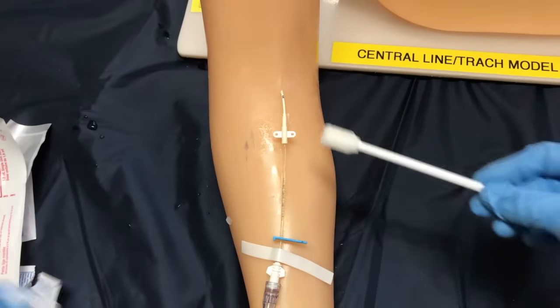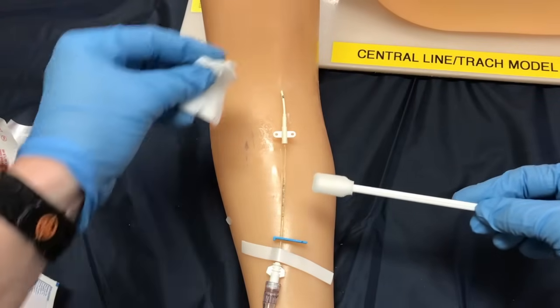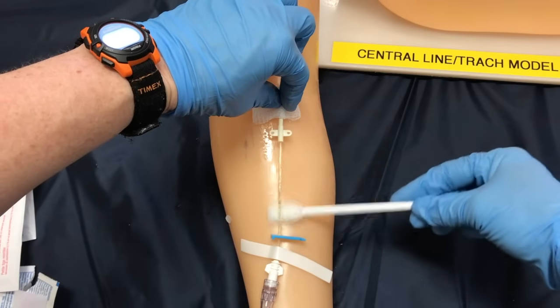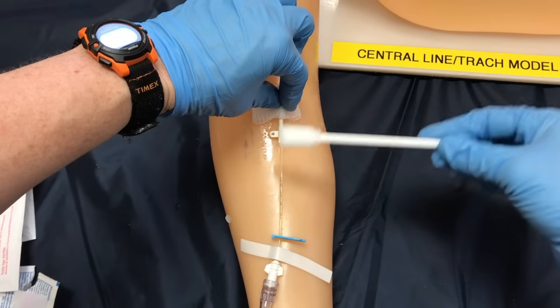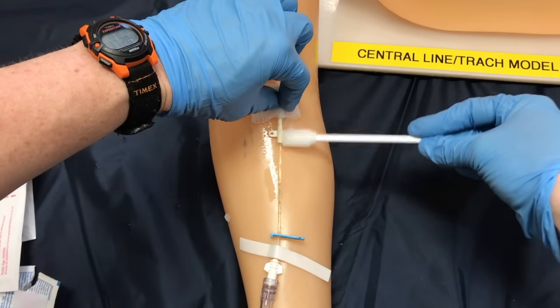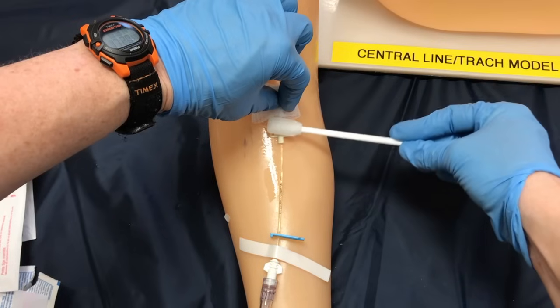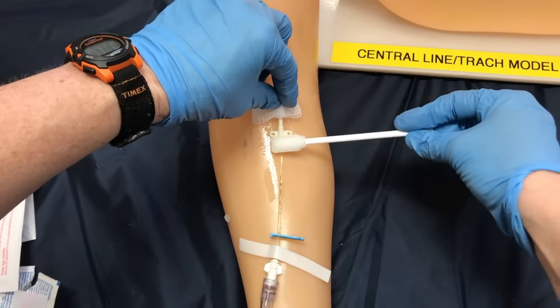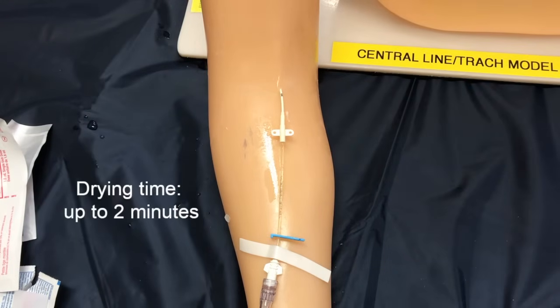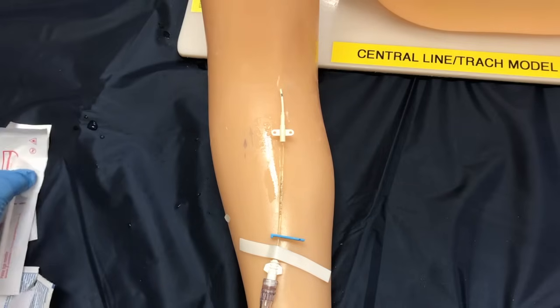The final chlorhexidine swab is for underneath the line. Here's where I'm going to use my sterile two-by-two to support the line so I don't accidentally pull it out, and clean underneath. Then I'm going to flip it over and clean on top. Make sure you get into those areas where it might be a bit gunky. I can lift off my gauze and clean the rest of the line. We're going to let that dry — this might take two minutes — so this is a good time to get sterile if you're not already.